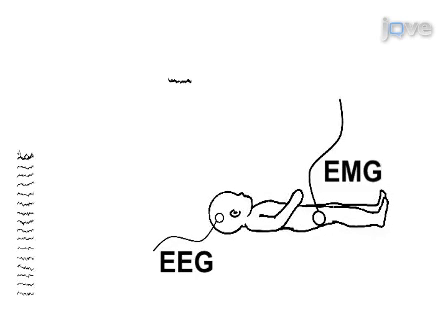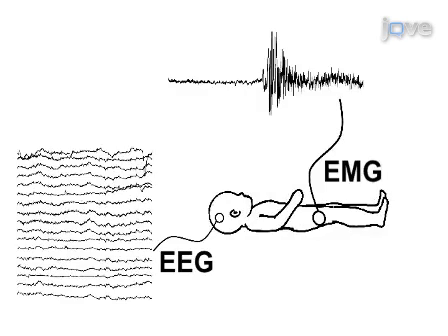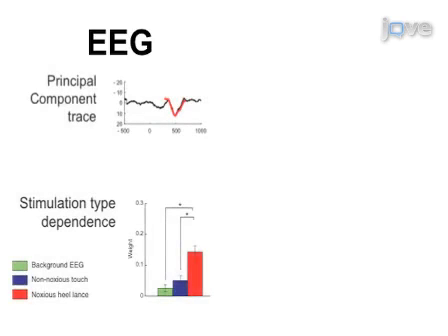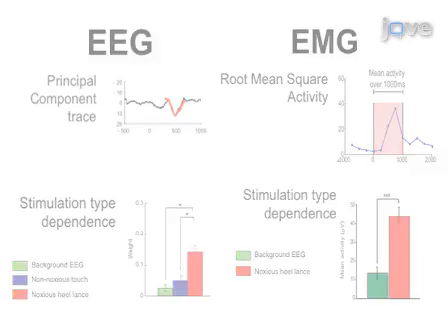Next, post-processing analytical techniques need to be applied to the data in order to characterize the evoked patterns of activity. Results can be obtained that show nociceptive specific brain and spinal cord activity can be recorded from the human infant brain. This method will help us understand how the developing nervous system responds to noxious stimulation.